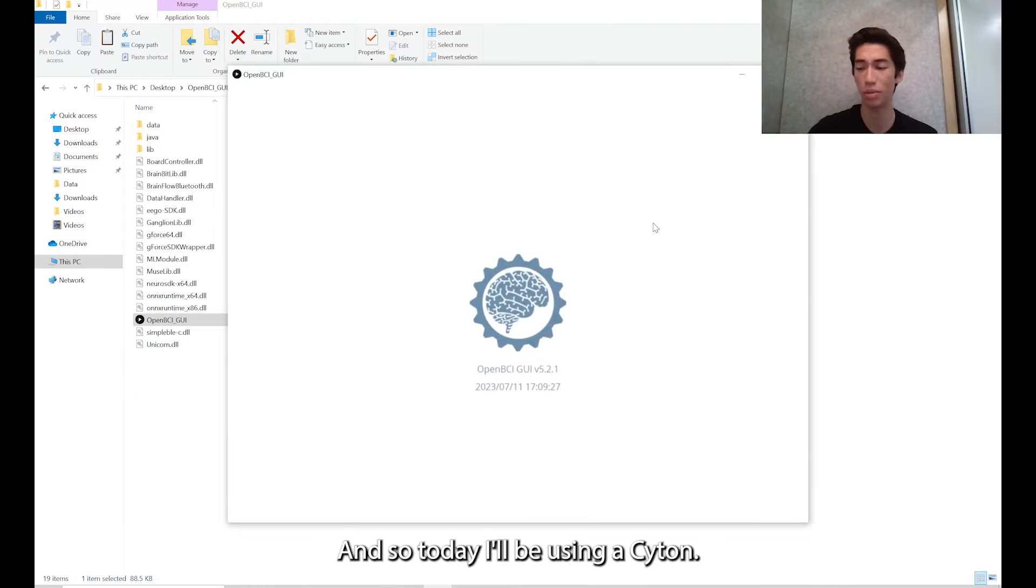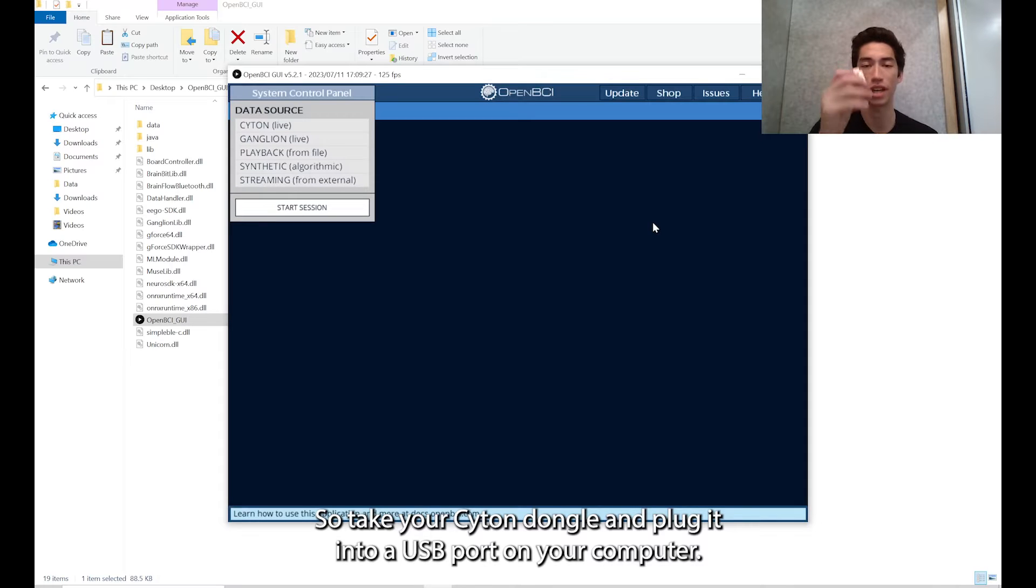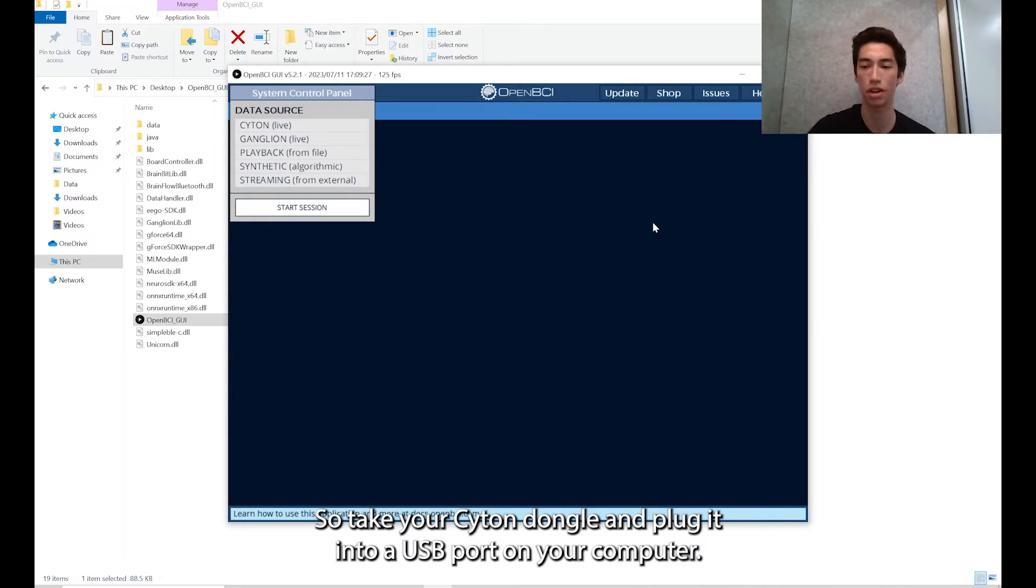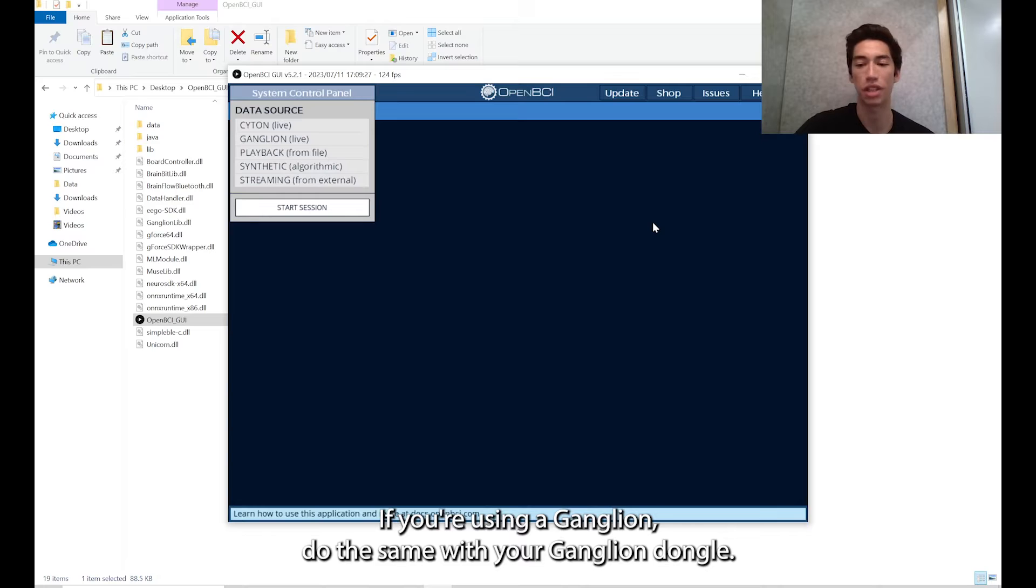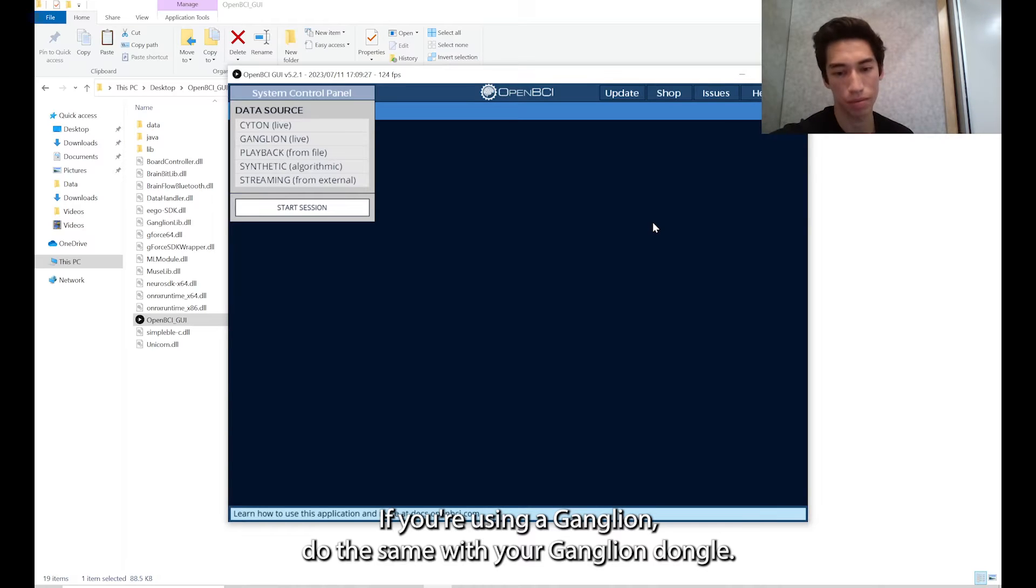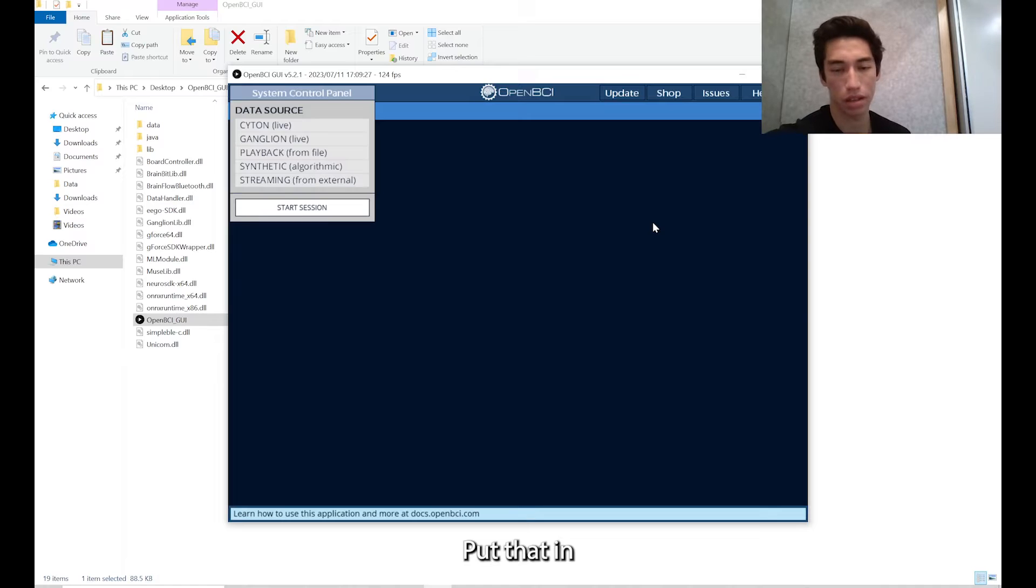Today I'll be using a Cyton. Take your Cyton dongle and plug it into a USB port on your computer. If you're using a ganglion, do the same with your ganglion dongle.